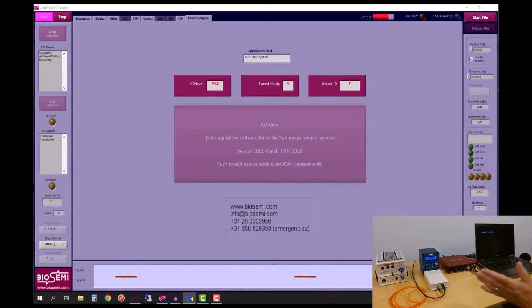Then your codes are perfectly aligned with the sound, and there isn't any way to do that any more precisely than this is doing. Except potentially to raise the sample rate. Right now I have the sample rate relatively low for this device, but we can go to a much higher sampling rate, and that might increase the precision somewhat.